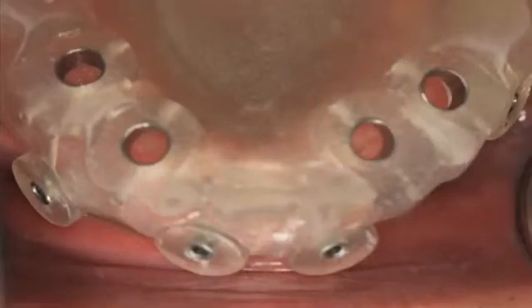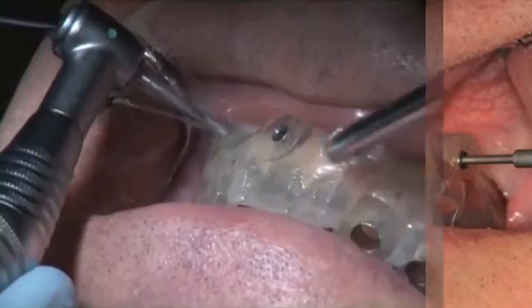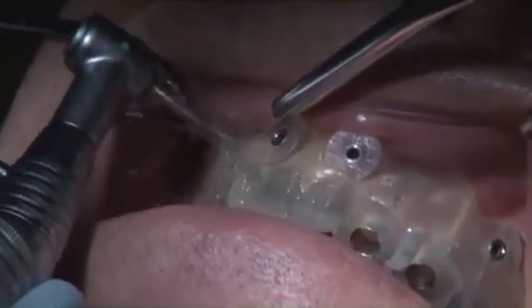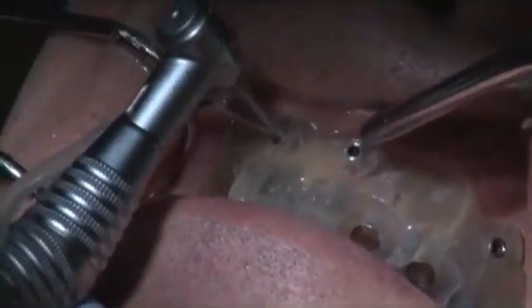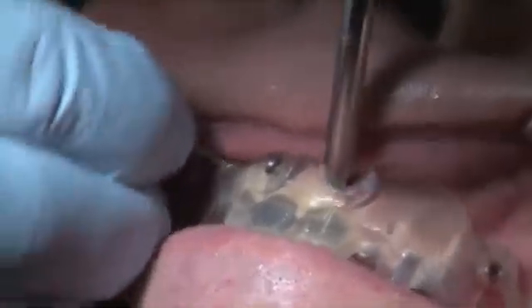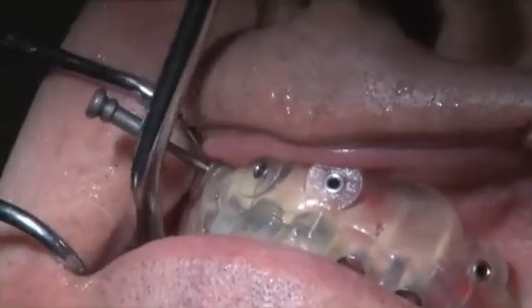The surgical guide needs to be seated completely and is anchored to prevent movement during the osteotomy preparation. This is done with the use of stabilizing facial pins that engage the labial aspect of bone approximately 3 to 5 millimeters. In the video, we'll demonstrate the placement of these pins.